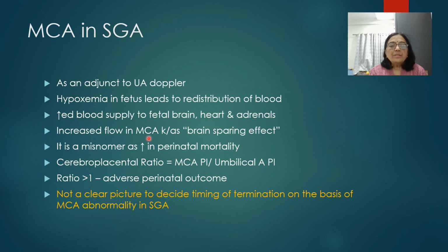Increased flow in the middle cerebral artery is traditionally known as the brain sparing effect, but unfortunately, it is not sparing the fetus. It is a misnomer, as on the other hand, there is an increase in perinatal mortality.